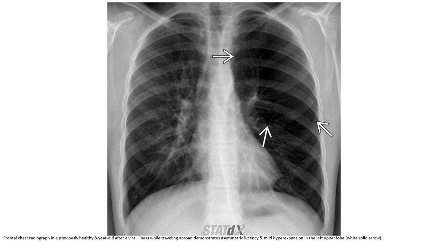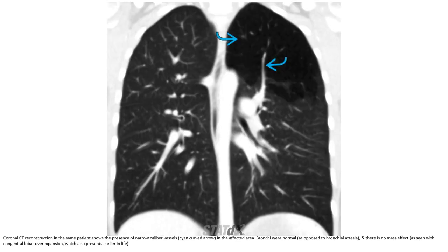Frontal chest radiograph in a previous case of a patient after a viral illness while traveling abroad demonstrates asymmetric lucency and air-trapping with hyper-expansion in the left upper lobe. Coronal CT reconstruction in the same patient shows narrow-caliber vessels in the affected area, with normal bronchi and no mass effect.